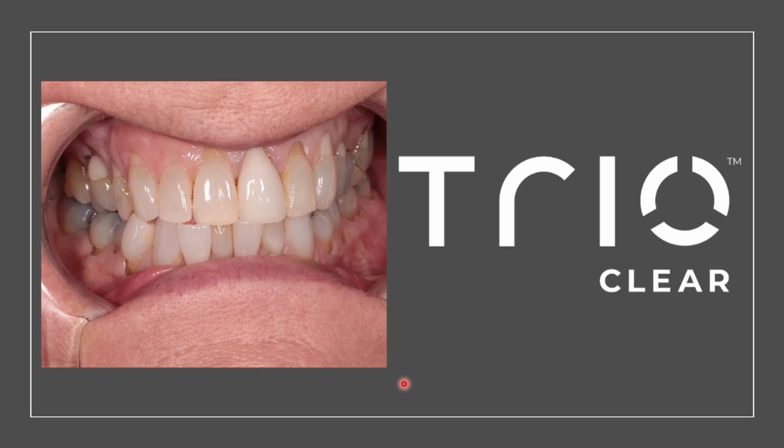We've got obviously this crossbite. We saw this at the start of the process of the webinar today. We've got this crossbite, which we now know is described as upper right 1 and 2 are in crossbite here. What this lady really wanted was veneers, and she didn't like the slightly oil rig appearance of the upper left 1 veneer. Again, I'm not criticizing that. That's just that veneer has served them very well, and she has a very low lip line. But she didn't like it, and she wanted it to be corrected.